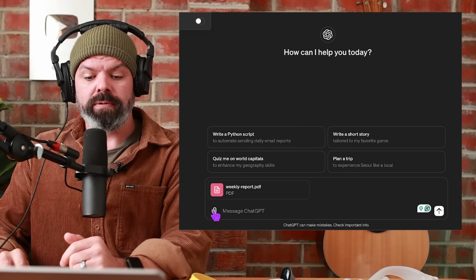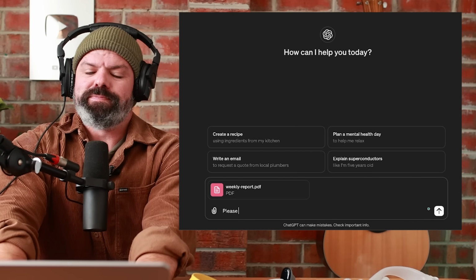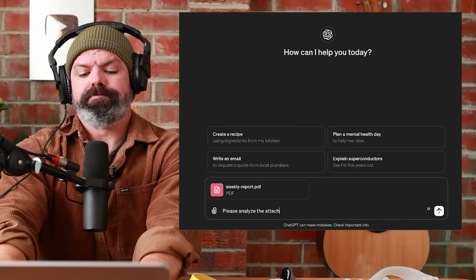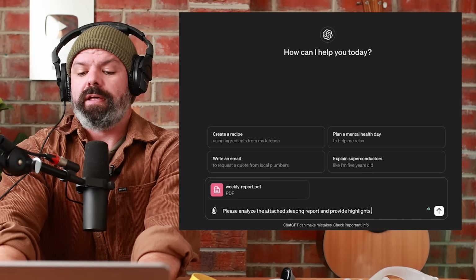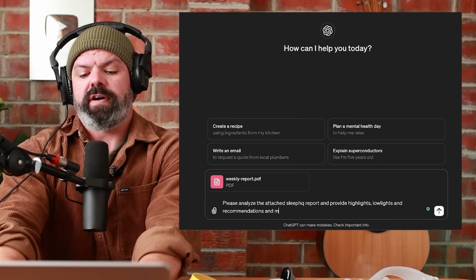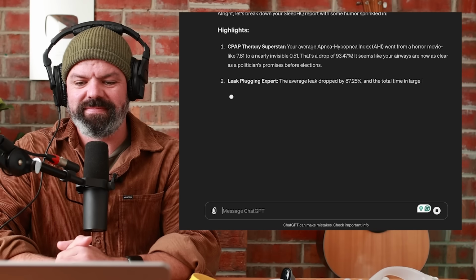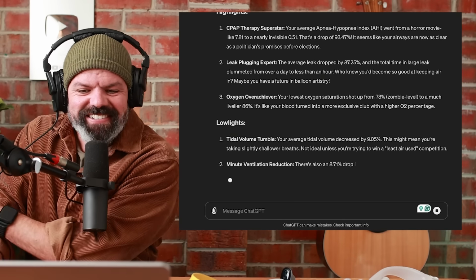So you just upload your report, click here, upload your report, and then just use your imagination. Please always use your manners when chatting with large language models. You'll get better outputs. There's a great tip for you right there. Please analyze the attached Sleep HQ report and provide highlights, lowlights, and recommendations, and make it funny. Here we go. This is great.